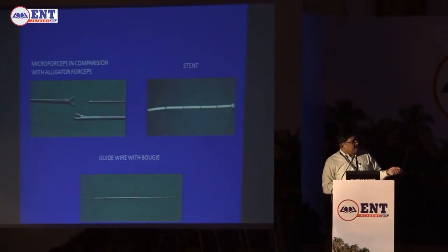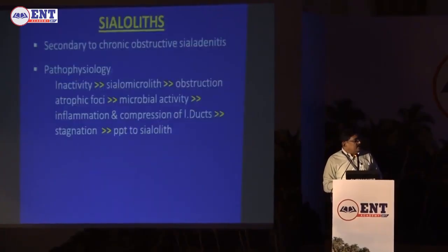I'm very proud to say this salivary stent is made in our country. Till recently it was imported. Now there is an excellent man who is doing it in Bangalore. Again, he does it for other specialties, and they are really good. You have these guide wires through which you can use these bougies. So this is a little about technique, how to do, when to do, and so forth.